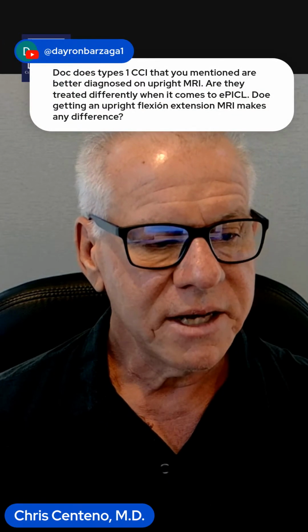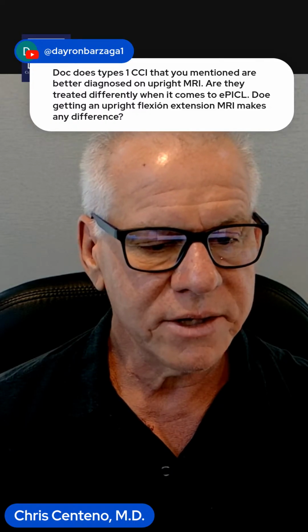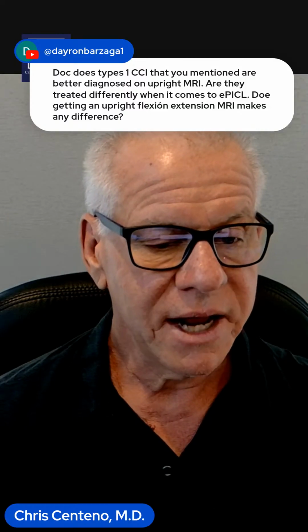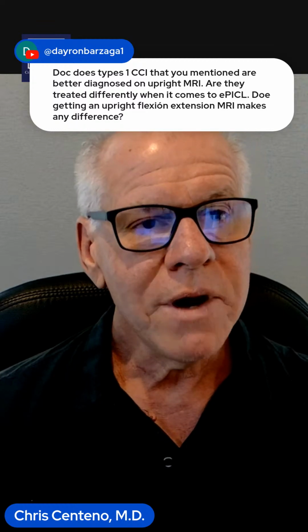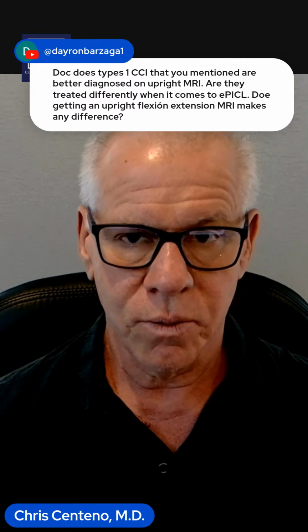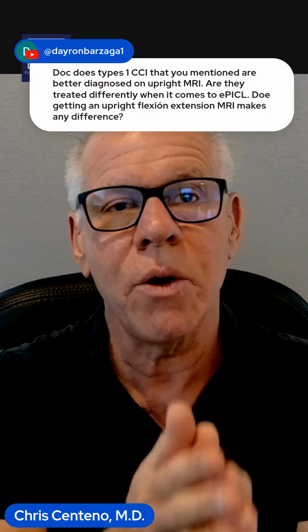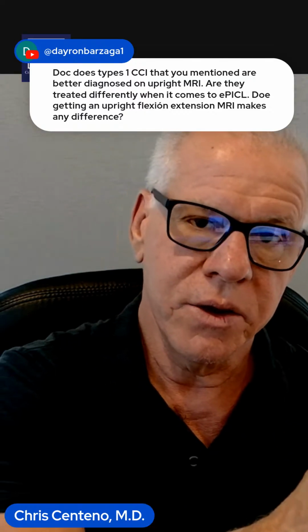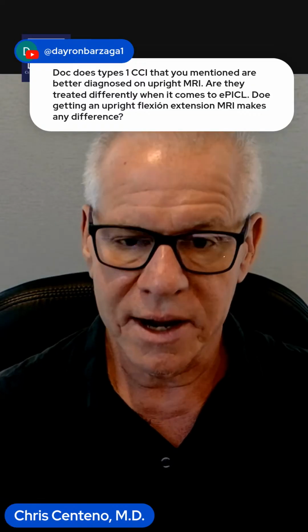Do type 1 CCI that you mentioned get better diagnosed with an upright MRI? Are they treated differently when it comes to EPICL? Does getting an upright flexion extension MRI make any difference? Yeah, realize that many of the structures that we're going to treat anyway at C0, C1 are really going to be done based on your clinical history, not necessarily an upright MRI.